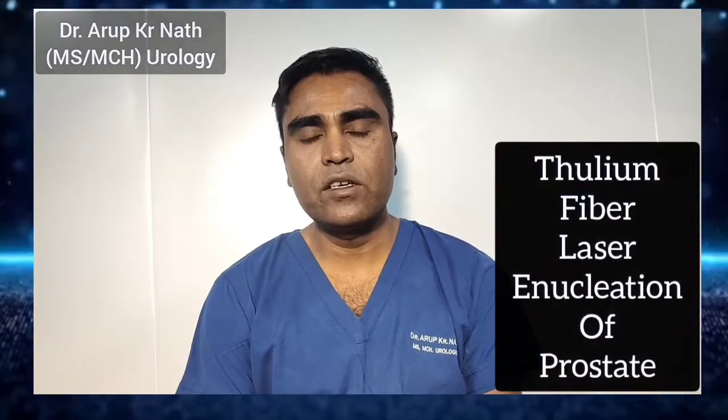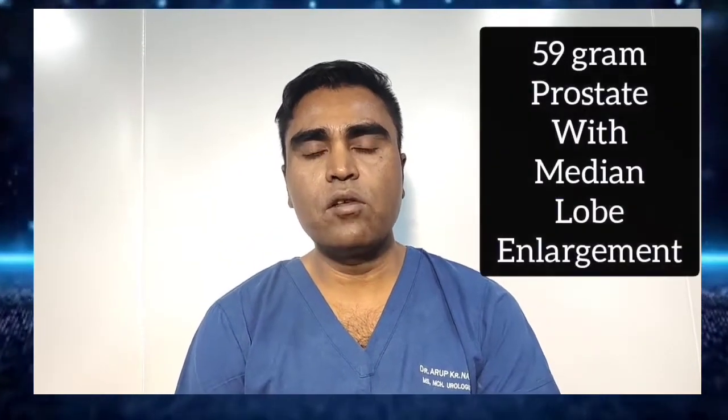Hello everyone. Today I am presenting this Thulium fiber laser enucleation of the prostate followed by morcellation. This is a 65-year-old gentleman without other comorbidities presenting with recurrent urinary retention, currently on a per-urethral catheter. On evaluation, his prostate gland was found to be 59 grams with median lobe enlargement. After preoperative evaluation, we selected this new technology of Thulium fiber laser enucleation. We kept the energy at 1 joule 30 watts for hemostasis and 1 joule 50 watts for incision.